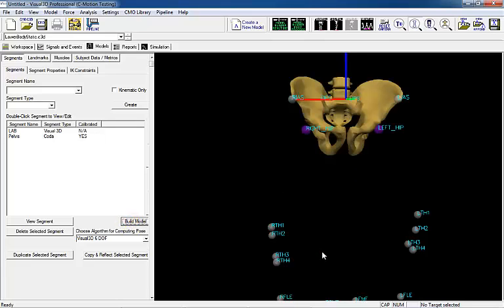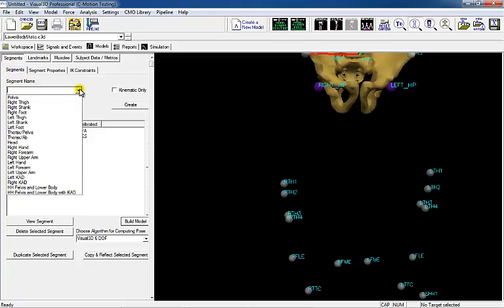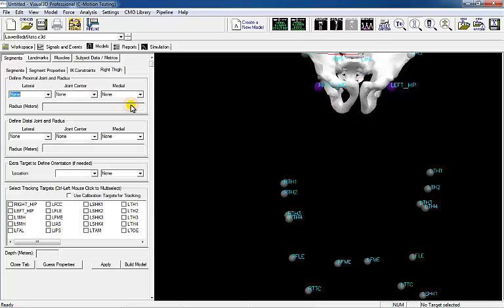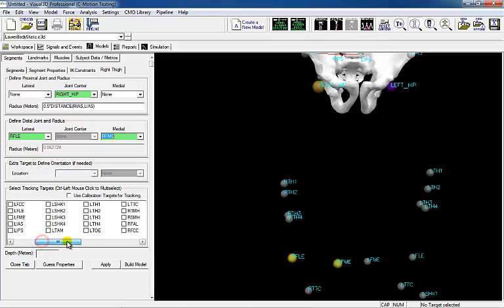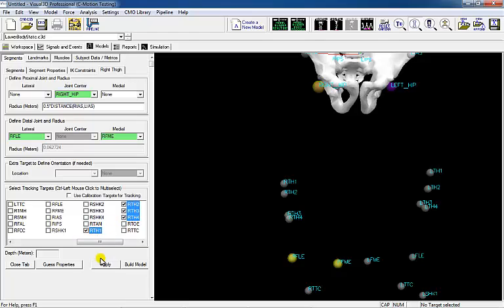Once the pelvis segment has been created, the thigh can be created using the hip joint center as the proximal end of the thigh. The location of the hip joint center was created automatically from the COTA Pelvis. Since one target is being used to define the proximal end, the radius of the thigh should be entered manually or defined using an equation, such as half the inter-ASIS distance. Use the medial lateral knee targets to identify the distal end of the thigh segment. Select the four targets on the thigh cluster as the tracking targets.